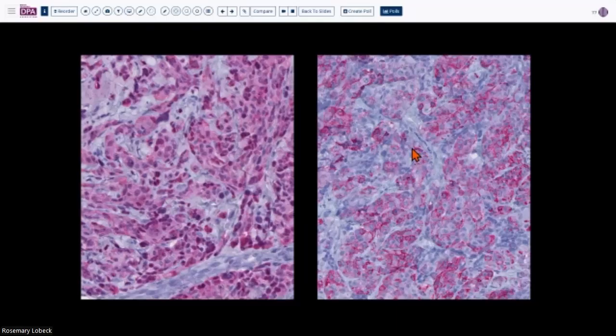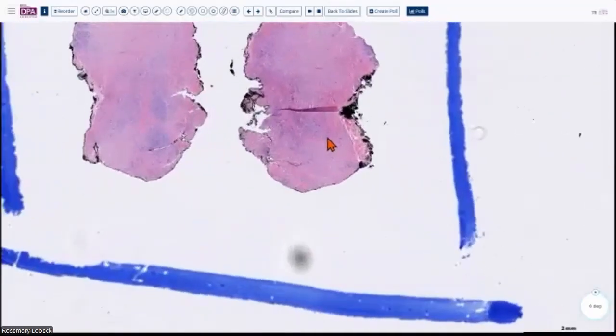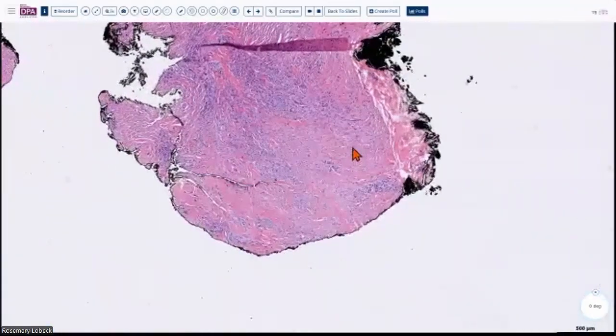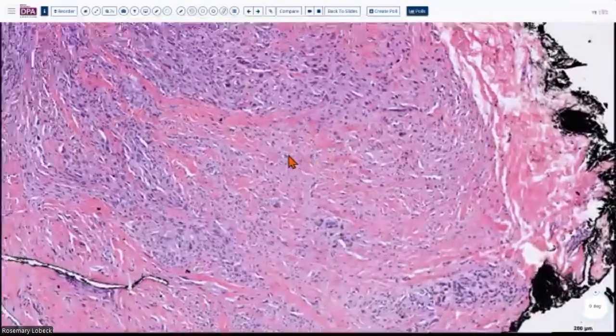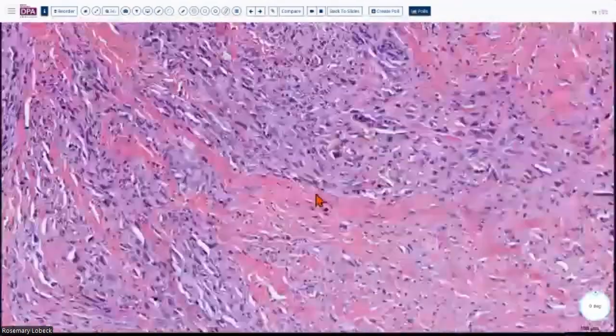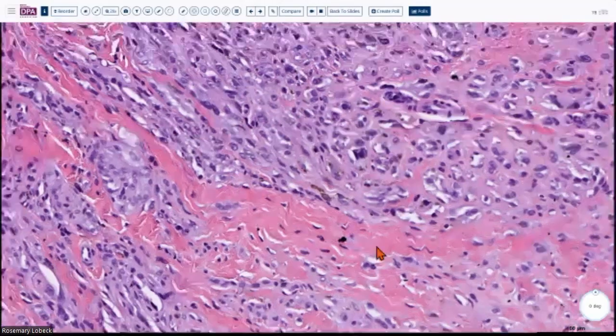So this is a melanoma? No, it's not going to be a melanoma because I'm not showing melanomas in this session. So it is a clear cell sarcoma, of course. So here's another case where clear cell sarcomas can actually form melanin pigment, right? So look at that. They do produce true melanosomes. That's why they are positive for all those melanocytic markers.